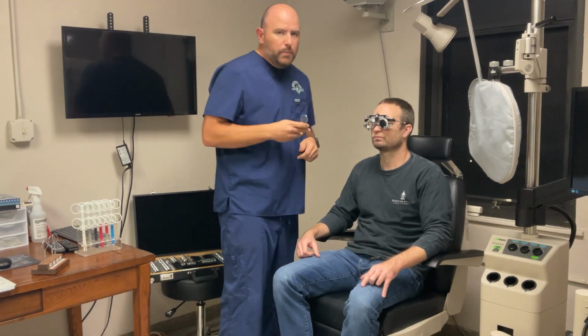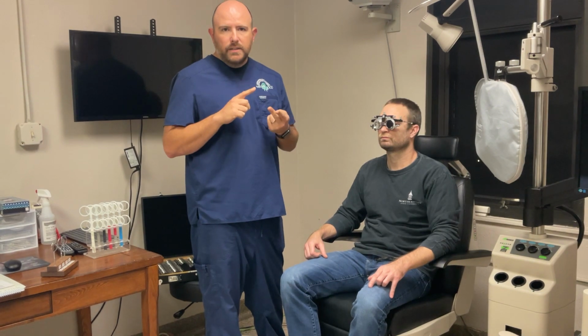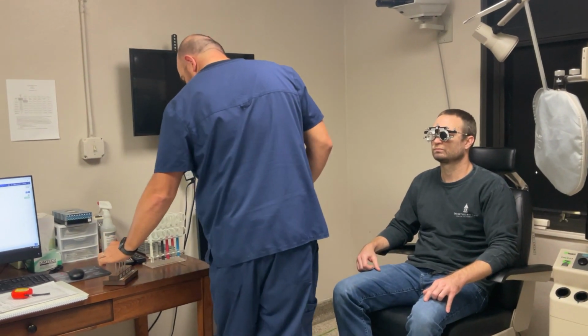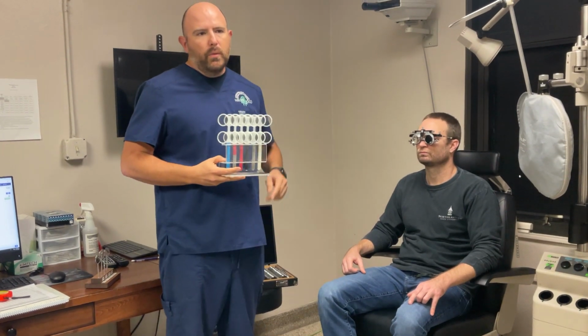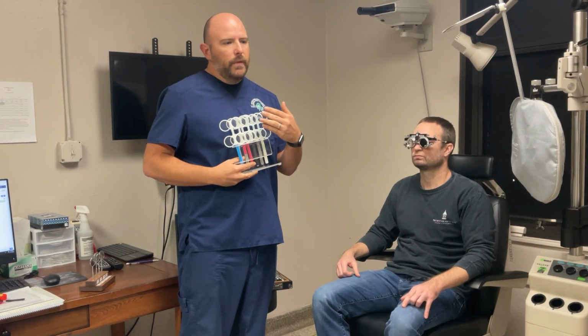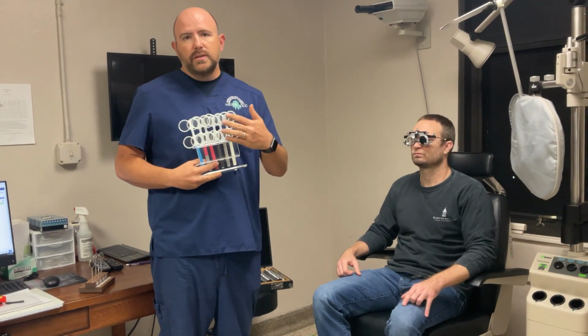All right, so at this point we have checked our initial sphere, we have checked our cylinder by doing power axis power, and now we're on to final sphere. So this is the point where things get a little tricky, okay? Because what we're wanting to do is we're wanting to avoid bias by showing the patient with the lens and without a lens. There are some patients who find that the vision is always clear with the lens, and there's some patients who feel like the vision is always clear without the lens. And so we want to avoid that bias.